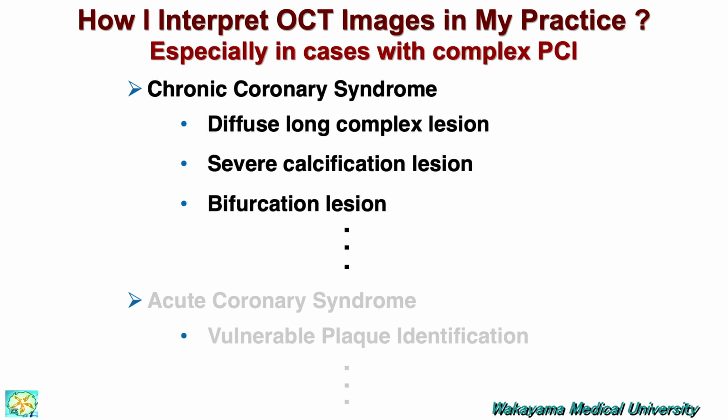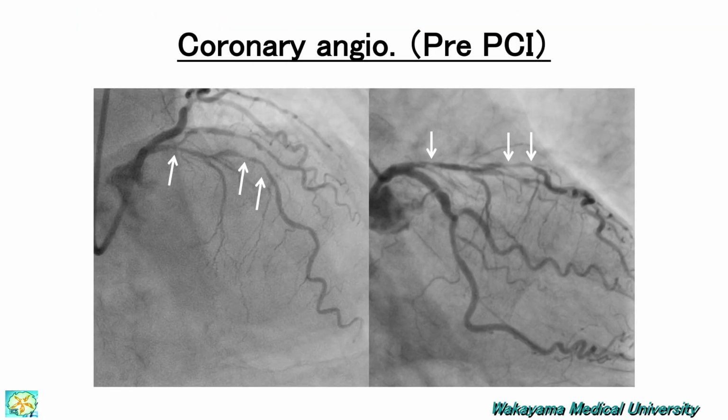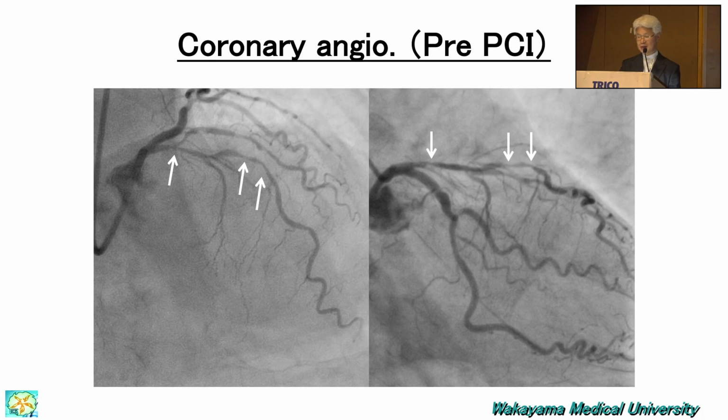And I'm very lucky to cut this portion because Samir already explained in detail. So let's move on to the diffuse long complex lesion. This is an LAD lesion, a very diffuse lesion, much more diffuse than the lesion we did in the morning today. Dr. Patel did a very wonderful procedure.